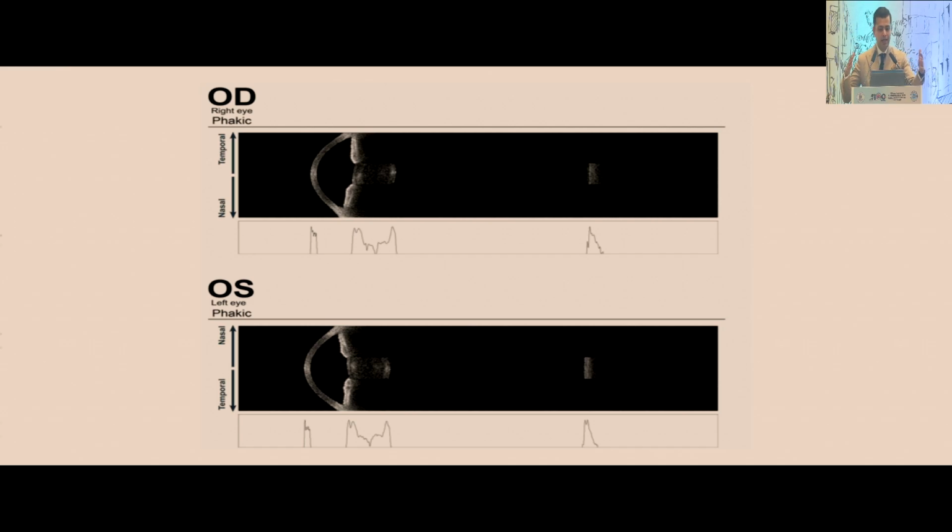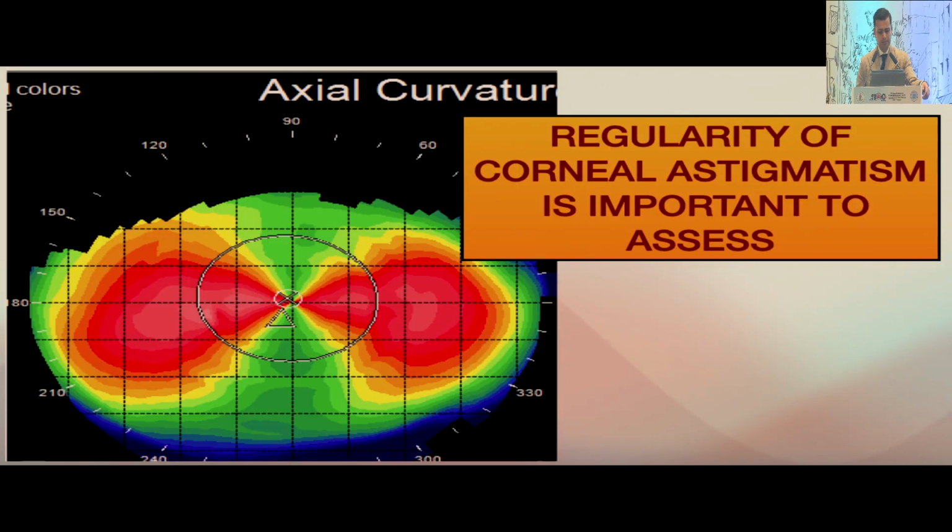So if a patient has an iris that goes posteriorly like this, so this is the Argos from Alcon, this is the biometer. But I think most good OCT biometers will have a built-in anterior segment module, and if you have a standalone anterior segment machine like a Visante or something, I think it's worth, apart from white to white or seeing the sulcus, to also look at the anatomy of the iris, because these patients may land up with issues later.